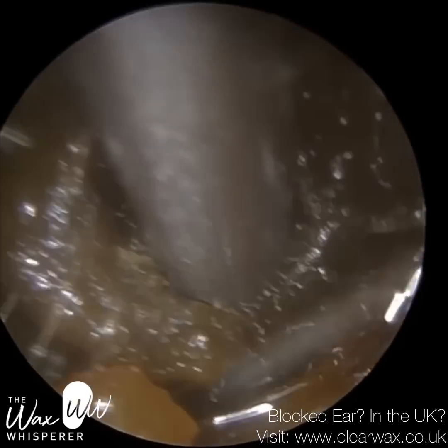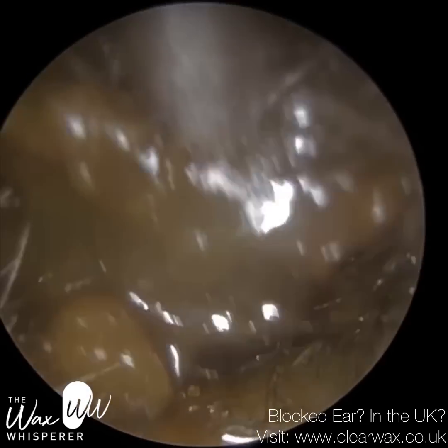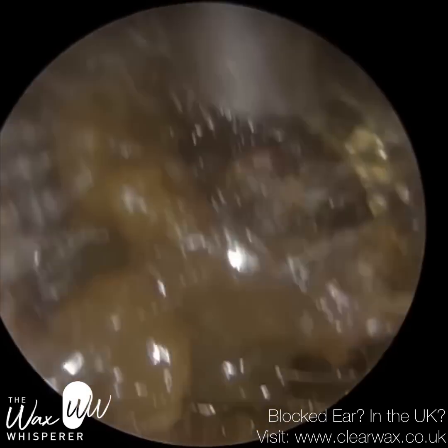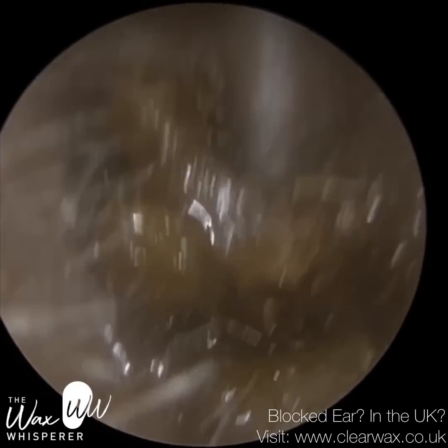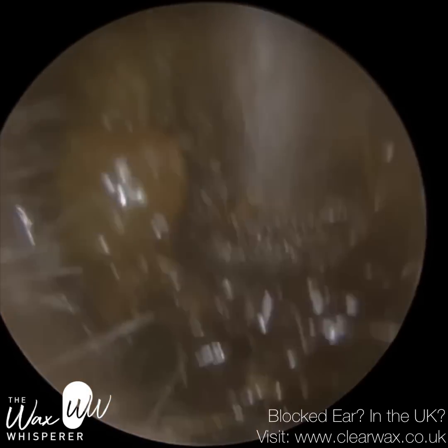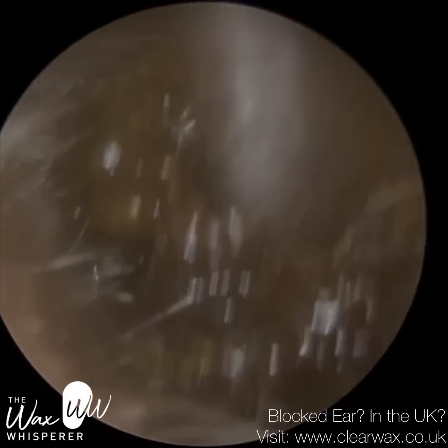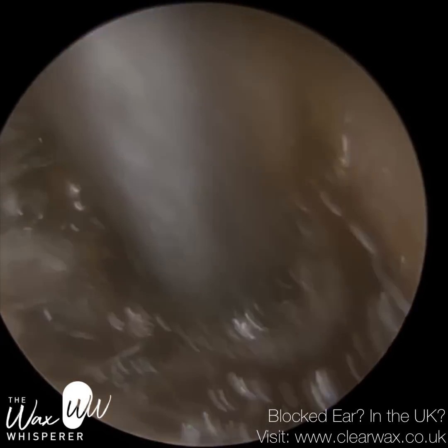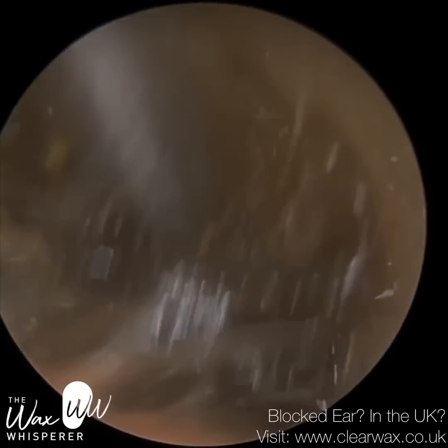That consists of epithelial skin cells. And when you use drops like sodium bicarbonate drops or hydrogen peroxide based drops, the skin again on the surface of the eardrum absorbs the water, and it starts to macerate. And you can see on that eardrum a slight maceration, softening, wrinkling effect of the skin. That'll be fine now. The patient doesn't need to use any more drops. Going to keep their ears clear of any water.